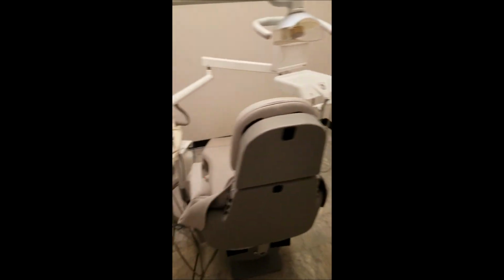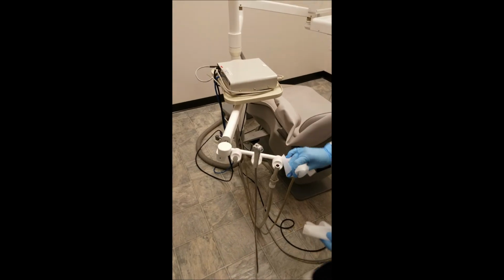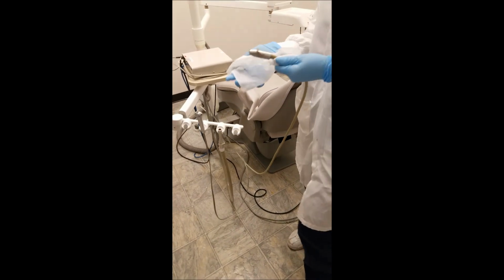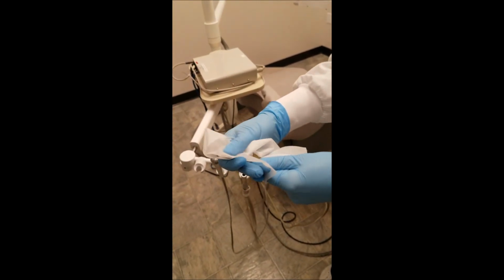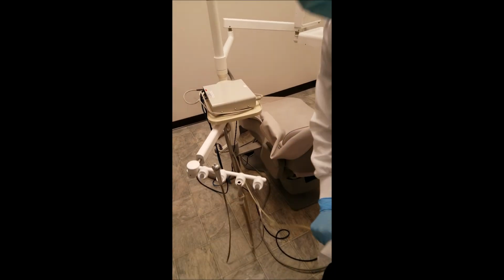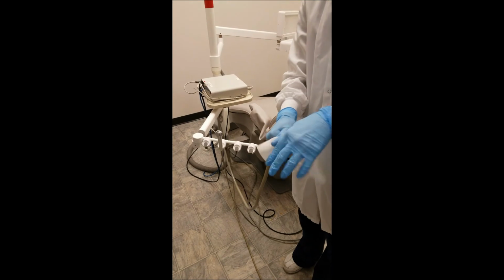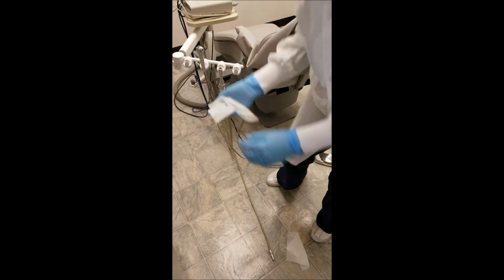Okay, and then she will do the accessory arm tubing and holder. So the whole arm. A helpful hint is to make sure that you turn the switch on and off so you get both sides. And that will be something you'll want to do for your pre and your post-infection control. Well, I dropped that, so I will re-wipe it and reset it up. Happens to the best of us.